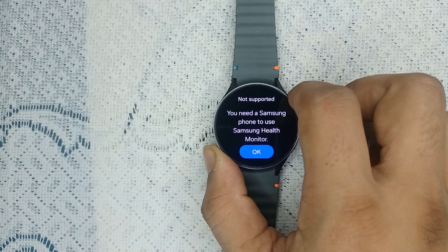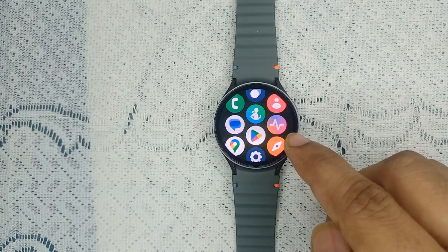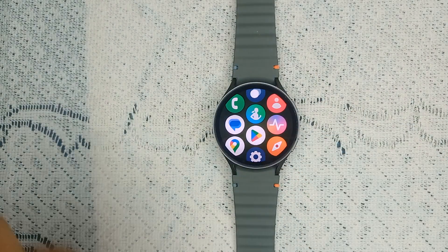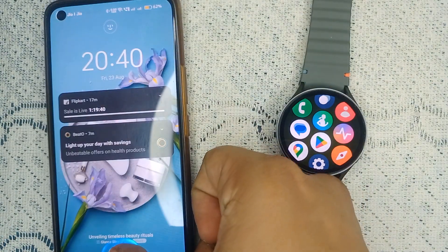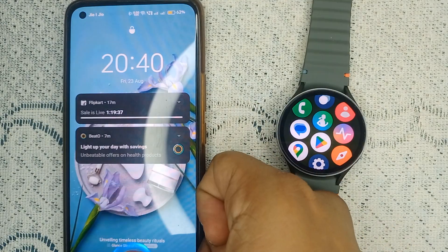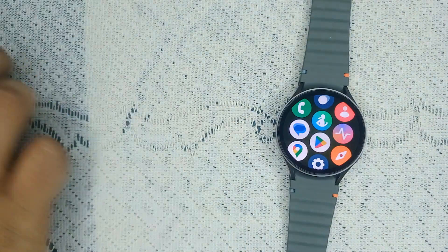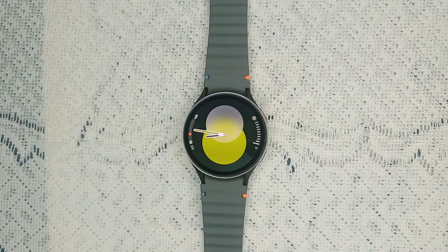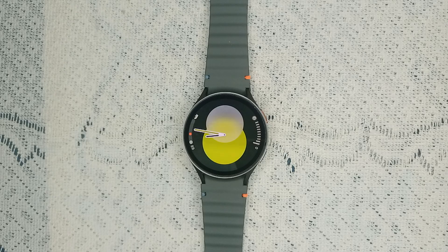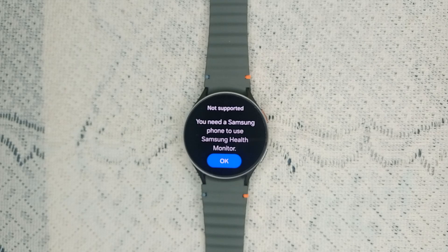Once you have a Samsung phone, you can simply pair it with your watch and then download this app — it looks like this logo. Right now I don't have a Samsung phone, so I'm not able to see this app on my Play Store. Also, this app is not available in the Play Store directly; once you connect your watch it will automatically pop up and be installed on your smartphone.